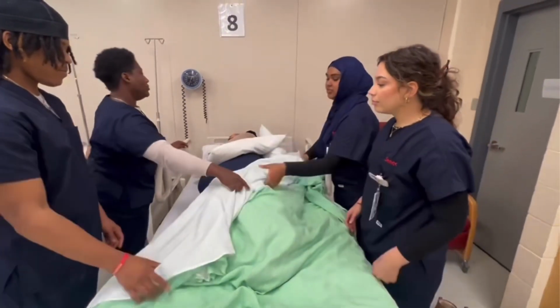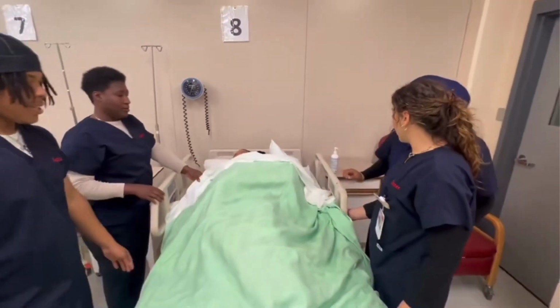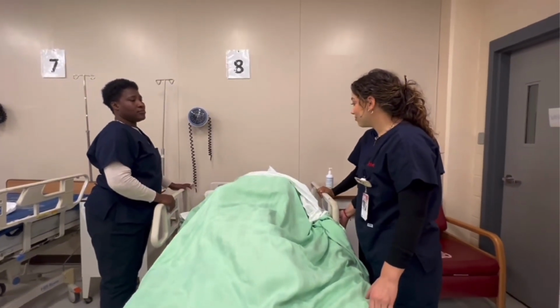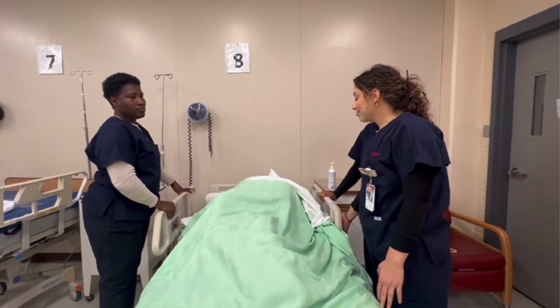And we're going to move the bed down back to the original position. We position the call bell close to her, so if she has any problem or needs any help ambulating, she can ring the bell for any assistance. And here we are lowering the bed. This position is supine to lateral on the left side.